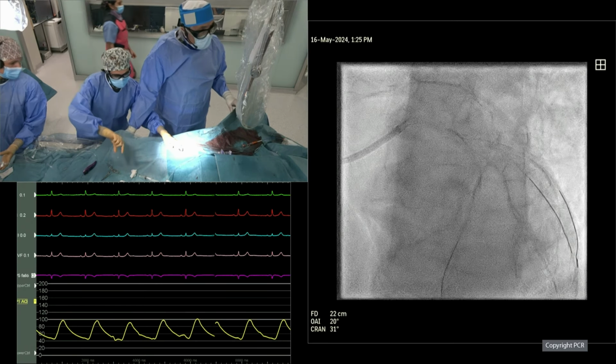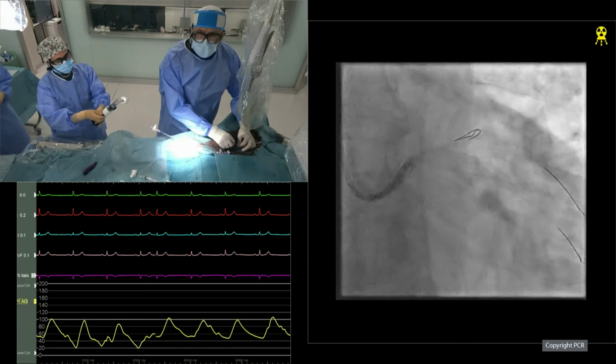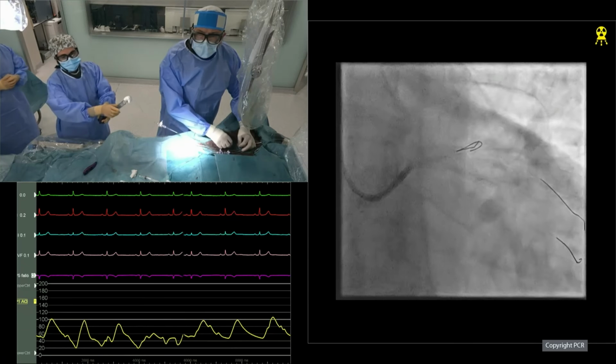Because we discussed this actually yesterday, and I promised not to mention it up front, but thank you for the audience. I think we don't have really clear data to support one strategy or the other. In my opinion, and I know I'm less experienced than all the rest of the panelists here, if you can avoid a stent in an ostial circumflex which is heavily calcified, that's not a bad idea. And if you can create lumen without creating a bad dissection, and avoid a stent, then I like to do it. But I think we need prospective randomized data to answer this question. I cannot propagate it for everyone, but that's my opinion.